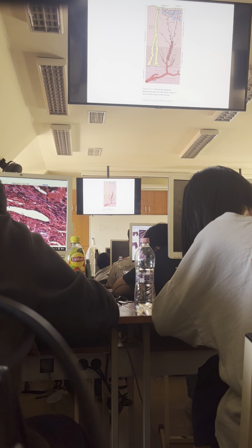Yes. Well, lacunae, yeah, I mentioned this. This is not so clear, but more or less, yes. Because if you enlarge here, we cannot really see these lacunae now in the proliferative phase. Yeah, okay. Anything else? Thickness of the endometrium, of course, is bigger in the secretory phase.